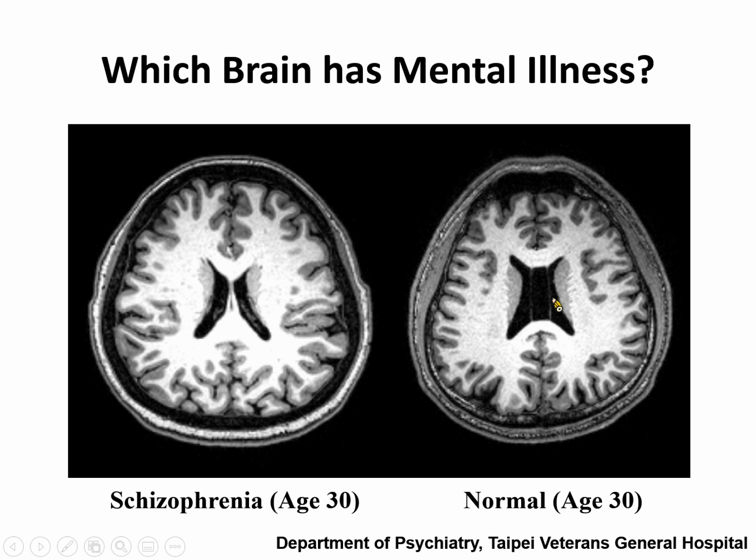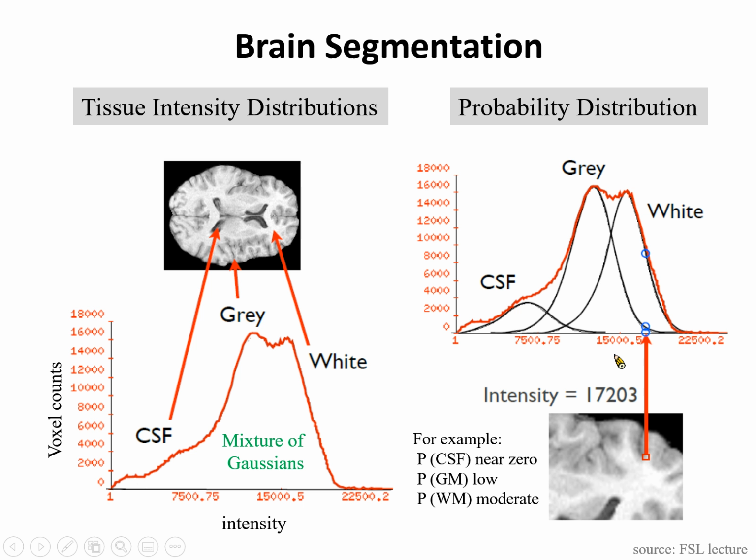In some healthy persons, you can see they also have larger brain ventricles and some increased volume of cerebrospinal fluid in the frontal area. That is a normal variation. So again, I want to emphasize that there are really no consistent visible patterns in neuropsychiatric disorders in brain imaging data. Okay, but then why do we still do today's course?